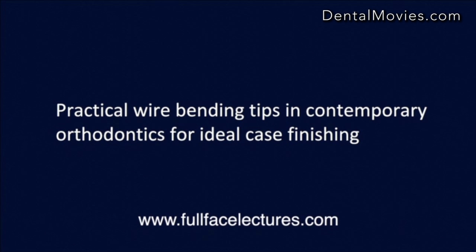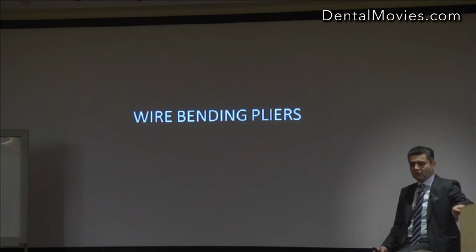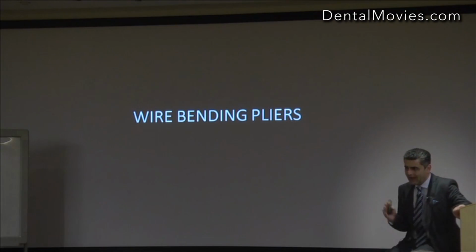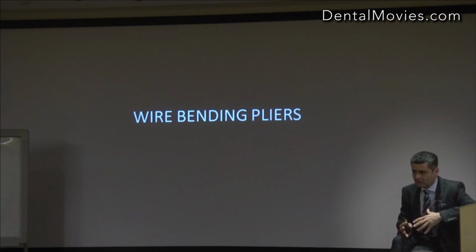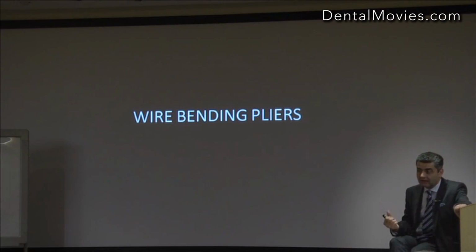Okay, so just a quick overview of what pliers I'd like you to have. You need these in your practice anyway. And then we can talk about it, because a good orthodontist will not only act and react with what's happening, with wire changes and elastics, but you need to wire bend. And that's a classic example of where wire bending should be done as soon as you get into TMA, right?